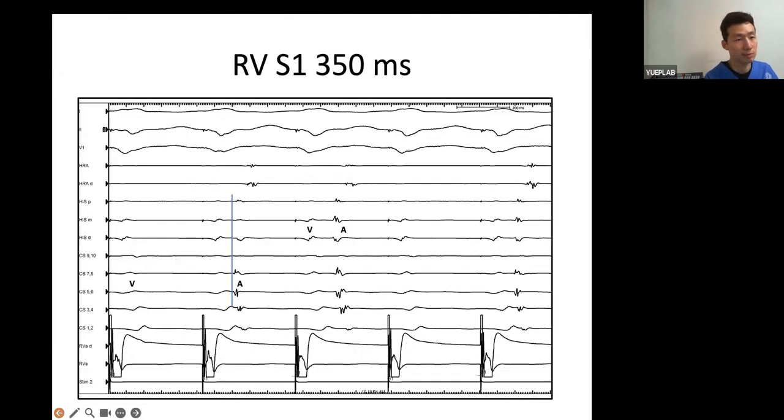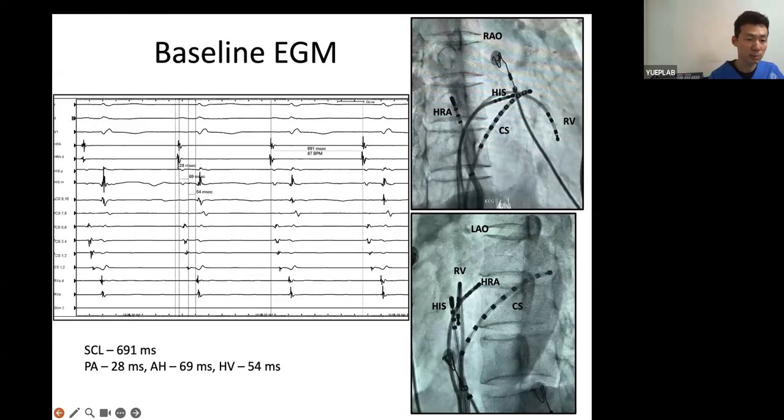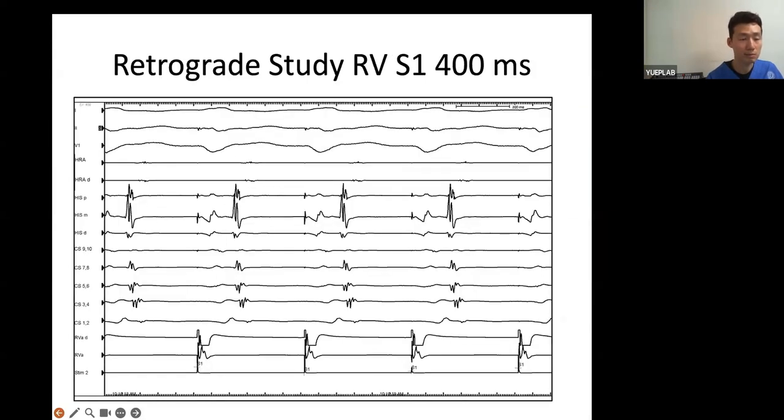All right. So you had the sinus rhythm, and then your baseline conduction, and you had a small his bundle, your HV interval normal, right? Okay, keep going. Next slide. So you had the S1, S2 here, sinus recovery time normal, you said, that's good. And keep in mind, the patient has right bundle branch block, okay? That's important now. During the V-pacing, his bundle is earlier.